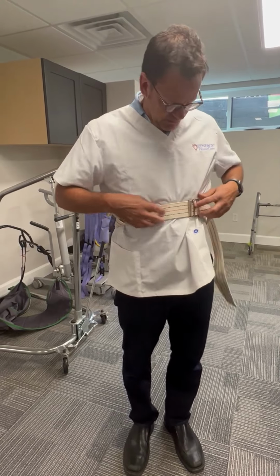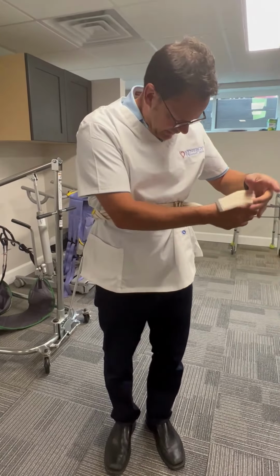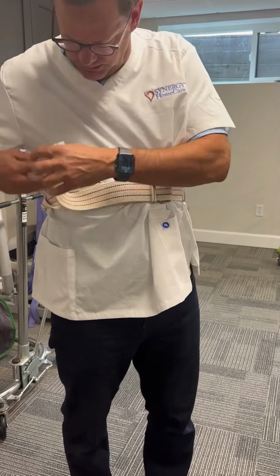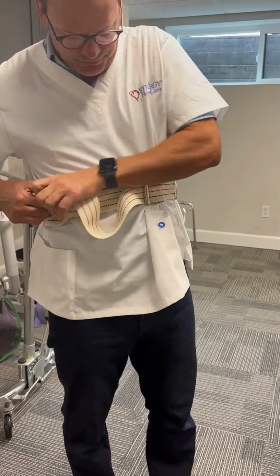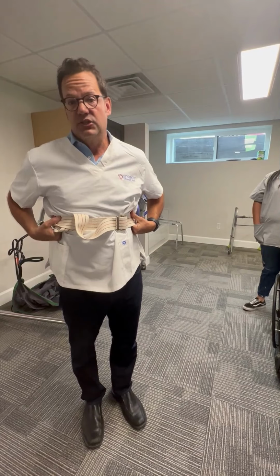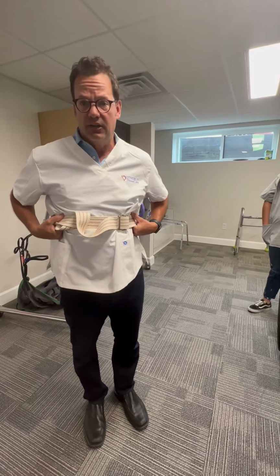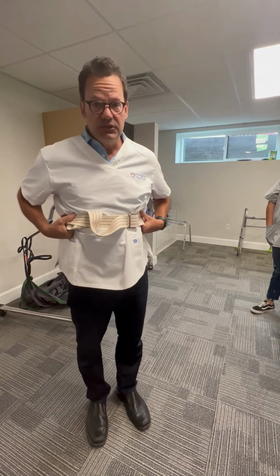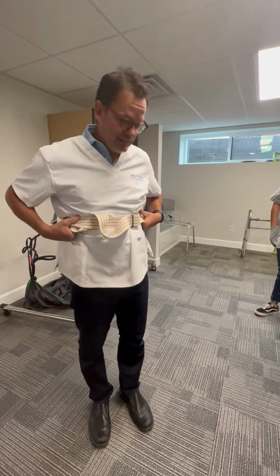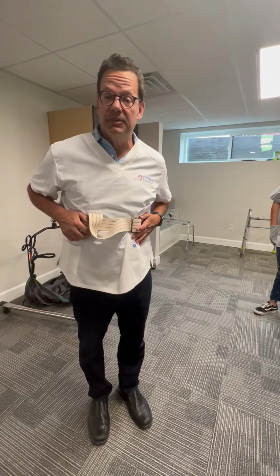You can see that I cinched it on myself, and I'm going to ask Giselle to demonstrate. You want to be able to comfortably get your hands, one or two hands, I guess two hands, underneath the belt, but the belt is firm on our clients. If it is loose, it is going to be very dangerous. So it is very important that it's snug on them. It has to be comfortable, but it needs to be snug.